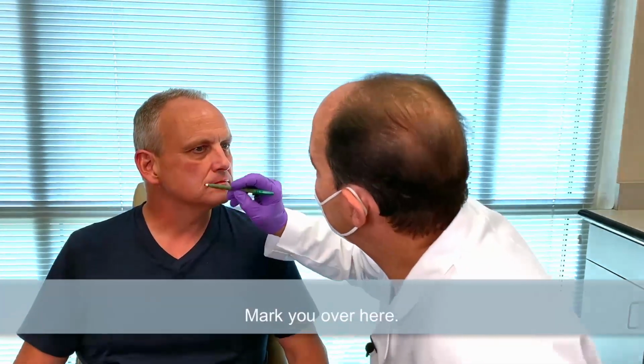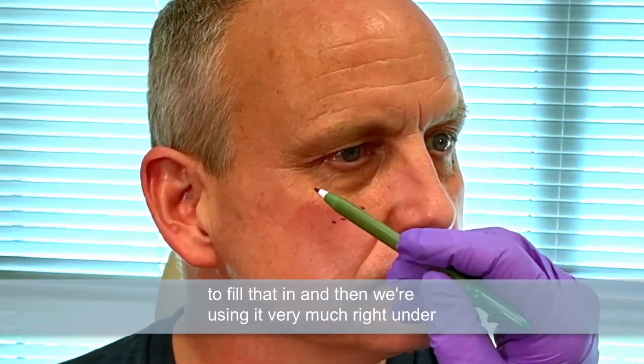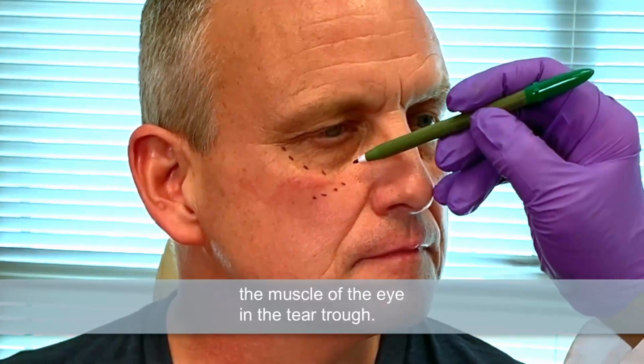I'm going to mark you over here. And again, that's where we're putting it down deep on the bone to fill that in. And then we're using it very much right under the muscle of the eye in the tear trough.